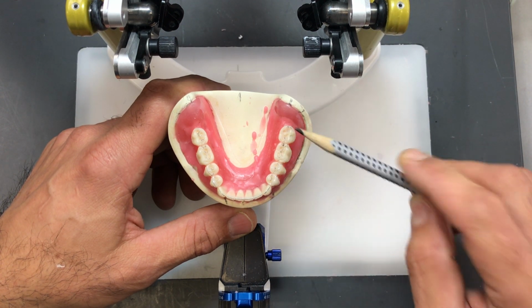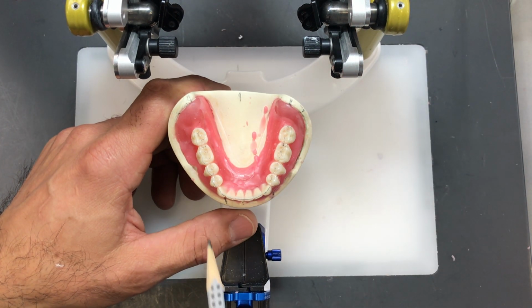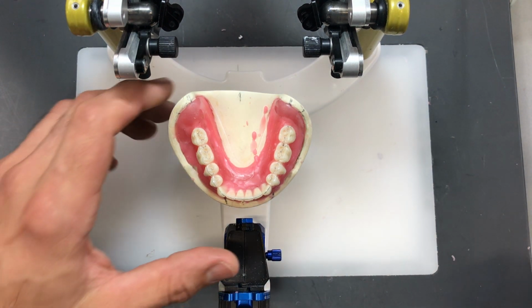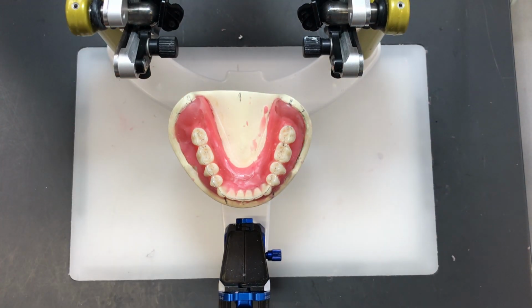I mean, we can go all the way to the back, all the way to the 7s. So we have this gentle transition. We have a symmetrical looking arrangement. Okay, so the left side is a mirror image of the right and so forth.